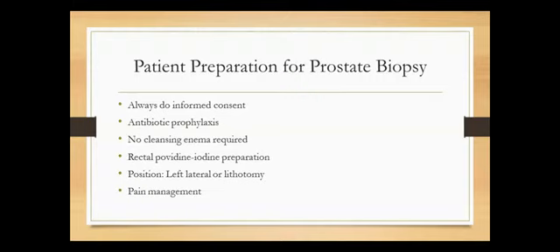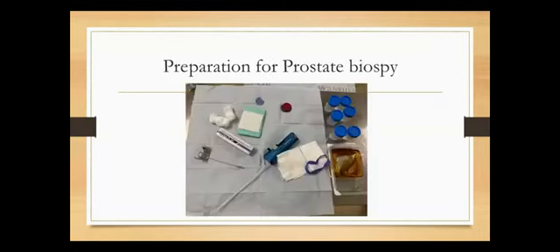With regard to positioning, you can position the patient laterally or in the lithotomy position, depending on which kind of prostate biopsy you are doing. And then you also have to take into account that prostate biopsies can be very painful, depending again on the type of prostate biopsy you are doing, and you have to give the patient analgesia or an anesthetic in that regard.